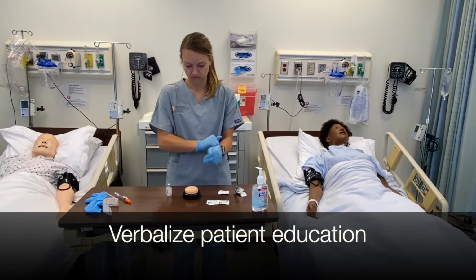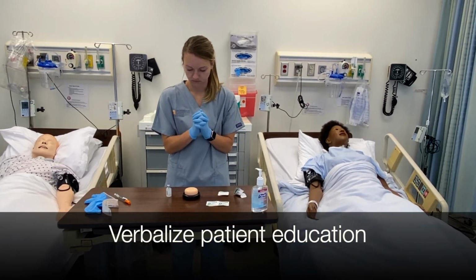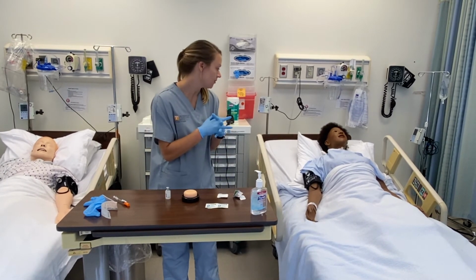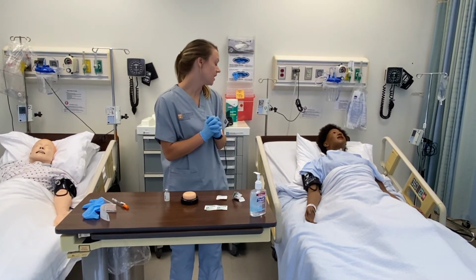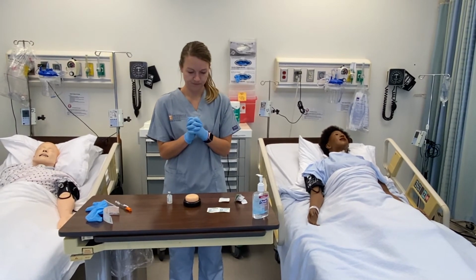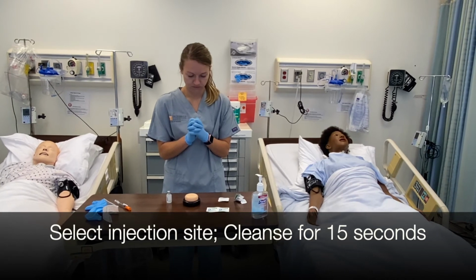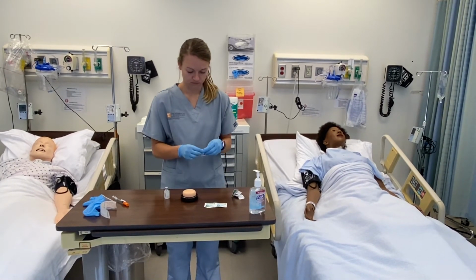Verbalize patient education, including the action and purpose of the medication. I'm going to be giving you your insulin today, which is going to help bring down your blood glucose level. Select appropriate injection site on patient and cleanse with alcohol swab in circular motion for 15 seconds.